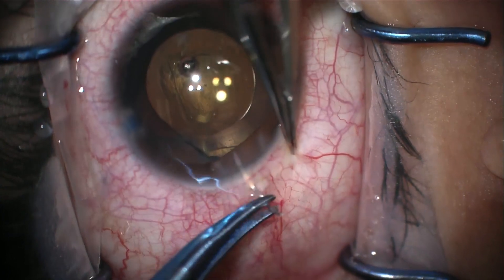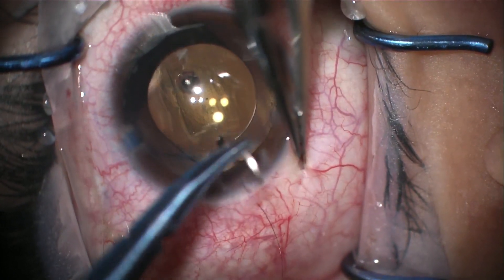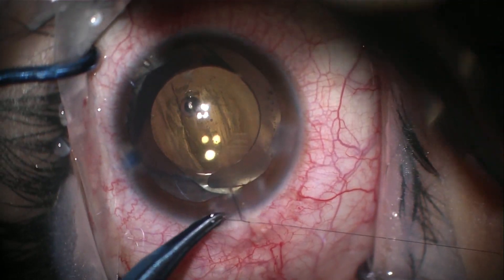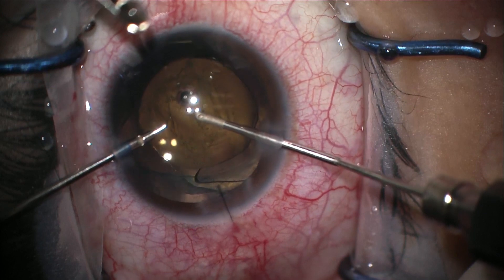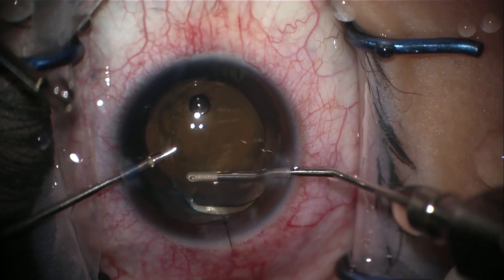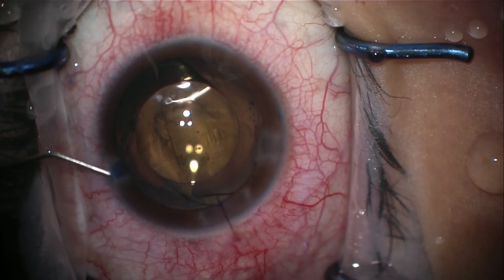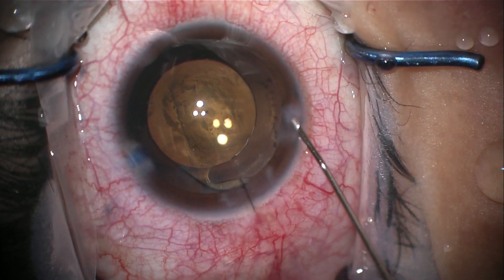The main wound is secured with a single interrupted 10-0 nylon stitch and the knot is buried. Irrigation and aspiration is used to remove the OVD from the anterior chamber. All wounds are hydrated and ensured to be watertight.